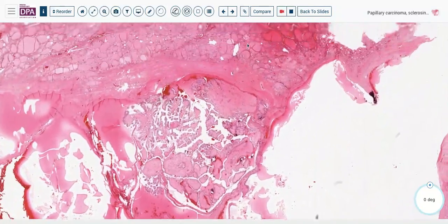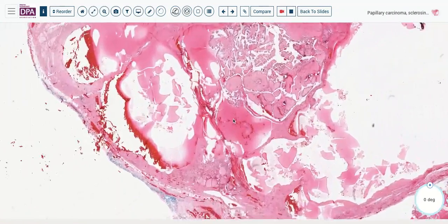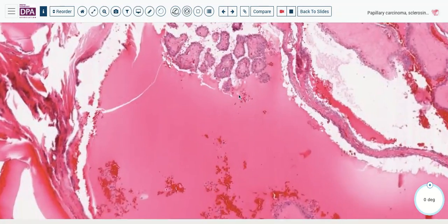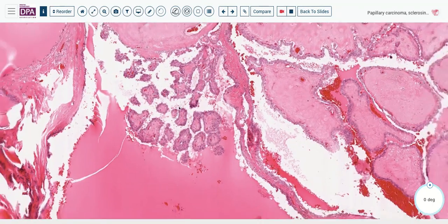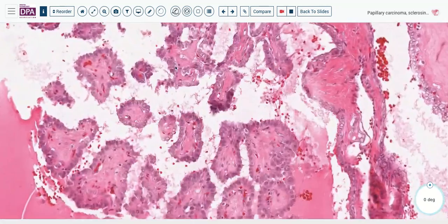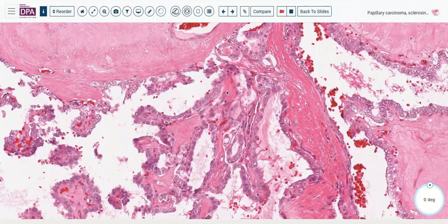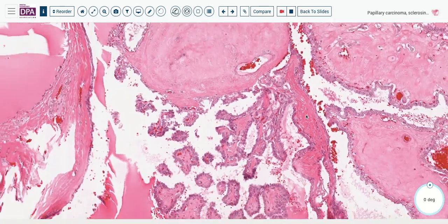And notice that it's really throughout this tumor. It's the outer capsule, as well as the papillae within. And even though you've got large cystic spaces, each of these papillae, by and large, has a pretty dense hyaline papillary sclerotic core, almost like clear cell carcinomas of the ovary or endometrium, which can have this very hyalinized sclerotic core. Some of these tumors will also develop hobnail type cells, as you have with clear cell carcinomas as well.